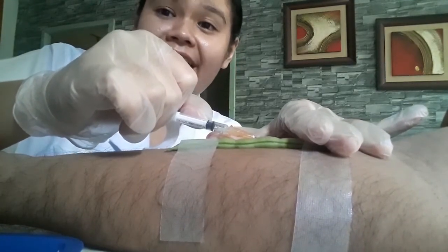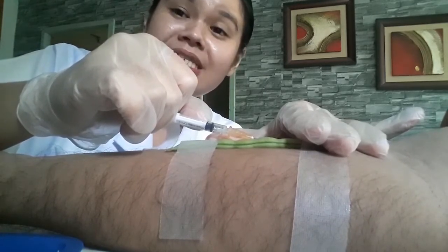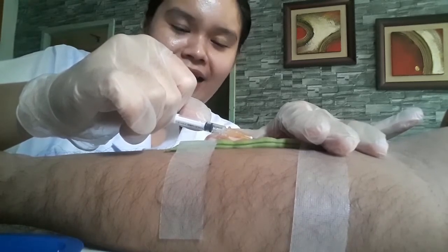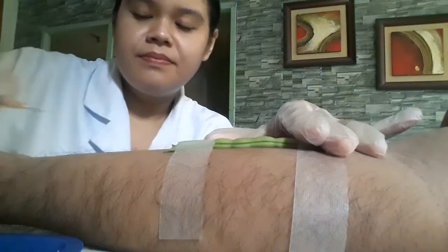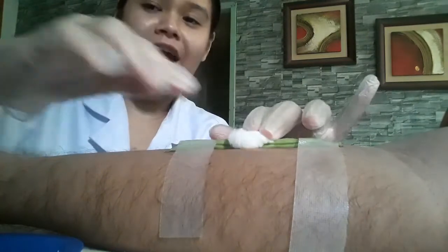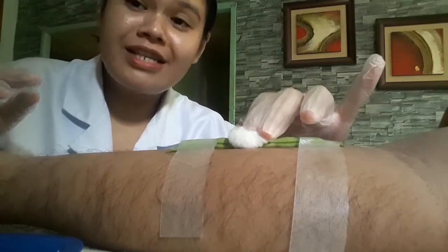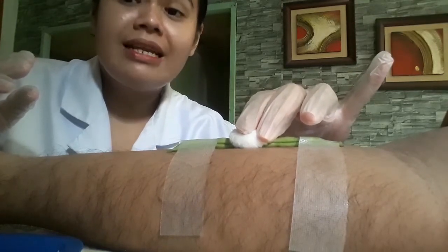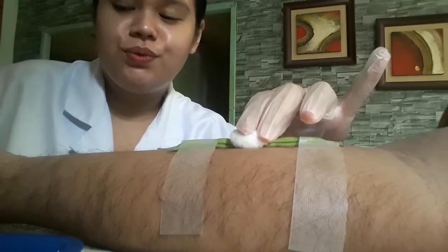If you see a resemblance of a mosquito bite on the patient's skin, withdraw the needle at the same angle and pat with a dry cotton ball. And remember, do not massage the site where you injected the medication because it might damage the tissue.